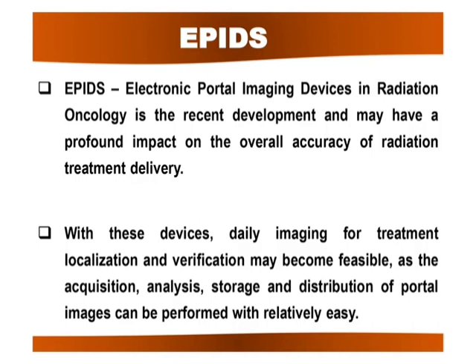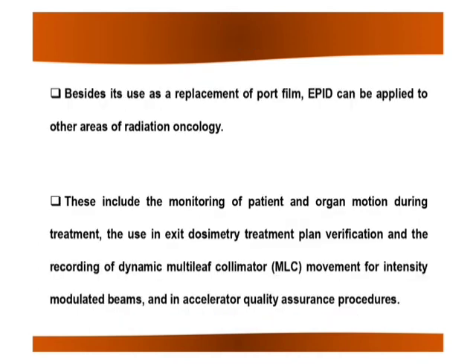In future, image acquisition, communication, and storage procedures for acquiring the different images, CT, MRI, PET simulation, for planning and verification will be part of an integrated system in the field of radiotherapy. The treatment planning and response assessment images can be used for planning, treatment and response, keeping in mind the importance of proper operational utility of the imaging modality, as the assessment of response and the treatment planning execution may be affected by improper knowledge about the imaging.